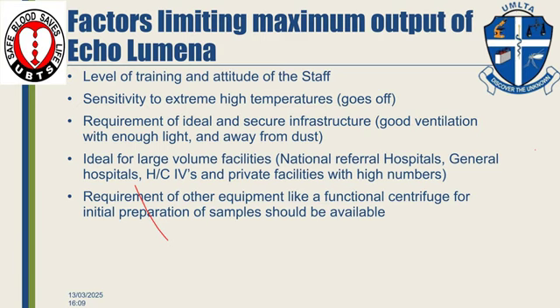This machine also is ideal for large volume facilities, say national hospitals where they have placed them, general hospitals, but we also have some health centers which have high volumes. In a case like Iganga, where I worked during my week, I saw the numbers are really very high.